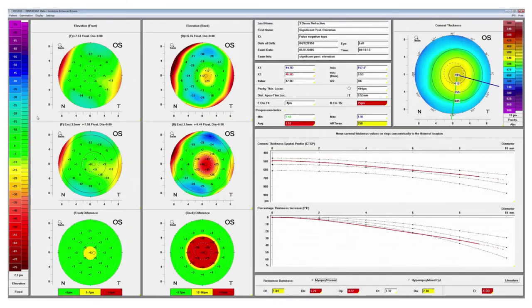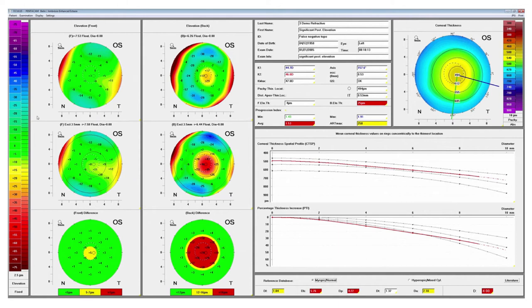Here's an example of a patient with early ectasia and again we see some abnormalities on the maps. Those are elevation maps and the ones that are turning yellow and red are the posterior elevation maps. We see some abnormalities in the pachymetric progression. We also see that several of the indices are turning yellow or red indicating that this is an ectatic patient.